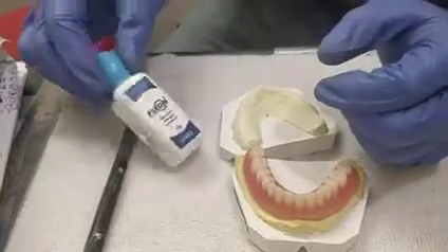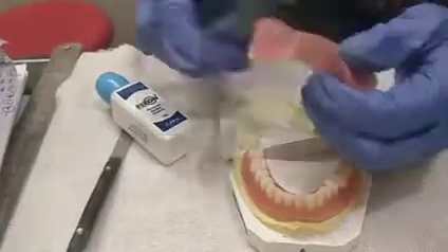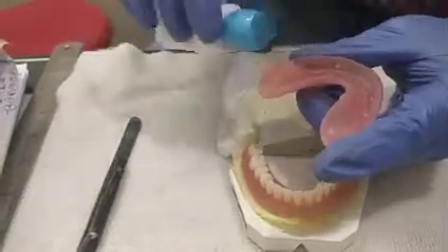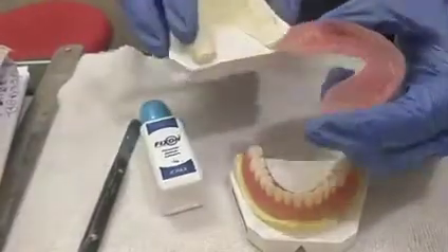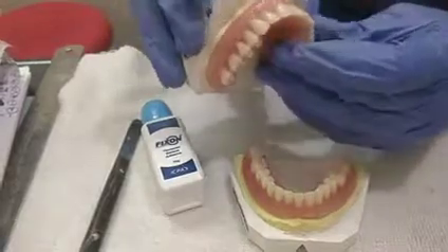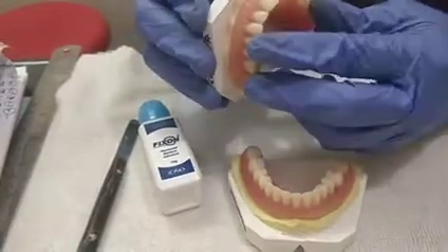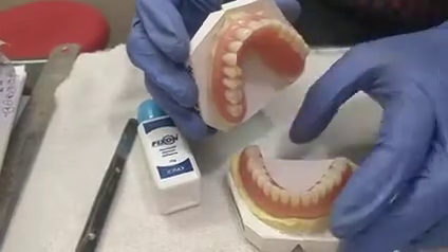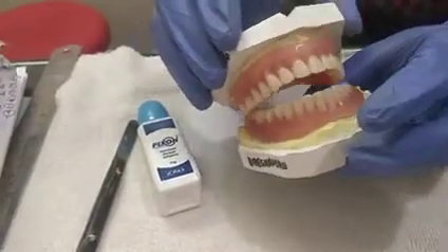They can manage it with this Fix-On flavored denture adhesive. They can just sprinkle this powder over the denture base and wear it, so that it could be in stable occlusion and they will have good retention.